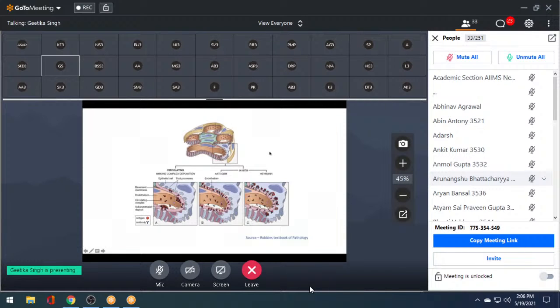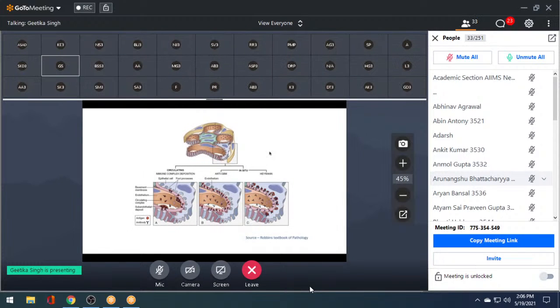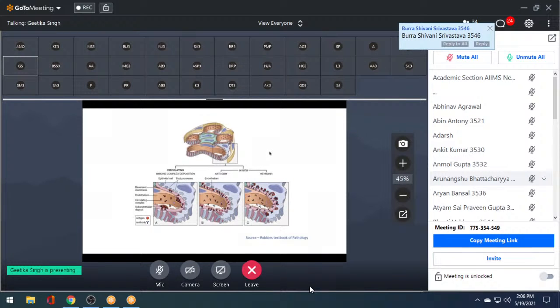So when we talk about these diseases, which are immune complex mediated, they tend to produce different types of proliferation. And we look at those proliferative patterns when we look at the kidney biopsy under light microscopy. But we cannot see those immune complexes in most cases. They are too tiny to be seen. Just like that, as you look in the microscope, you will not be able to see the immune complexes. So whatever we talk about on light microscopy is the reaction to immune complexes. So we say diffuse proliferative GN, mesangial-proliferative, membrano-proliferative, okay, and even membranous.